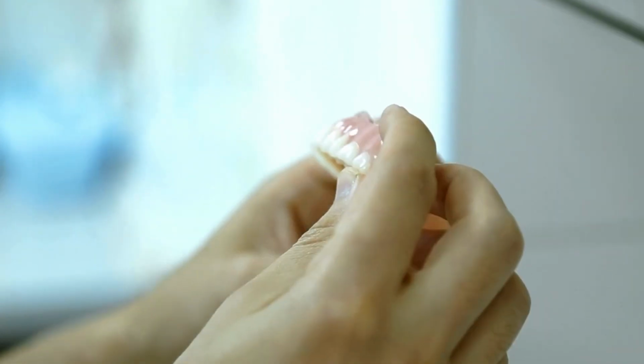So let's talk about that standard off-the-shelf denture that you got that was inexpensive, and you thought it didn't matter because you just needed some teeth. More likely than not, it doesn't fit, it moves around, it digs in, it's painful. A lot of times you might even have to take it out to eat foods you're comfortable with, because you can't function and it hurts to chew. These are not normal things for a denture.